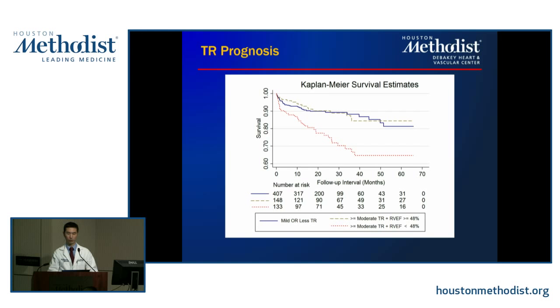Okay, so in an adult congenital world, CMR is actually recommended for quantitative assessment in these kind of patients. We'll belabor this. Okay. And last but not least, Dr. Nagueh presented elegant information on assessing pulmonary hypertension using echo.